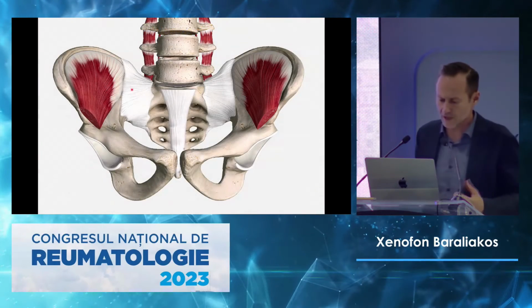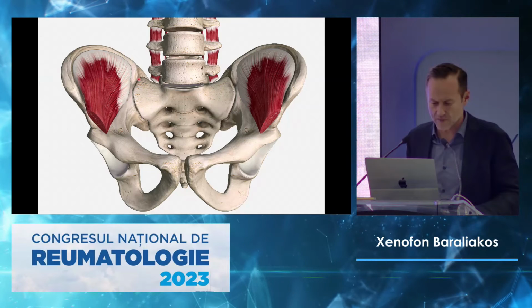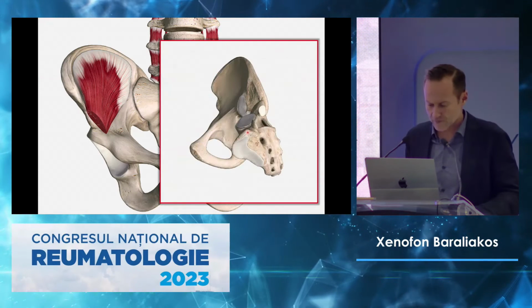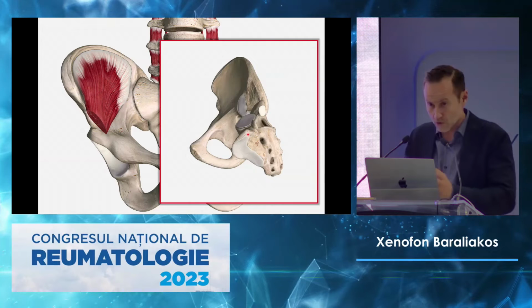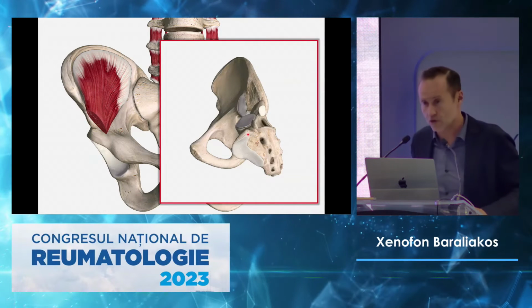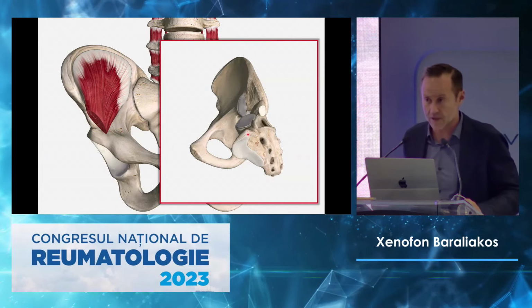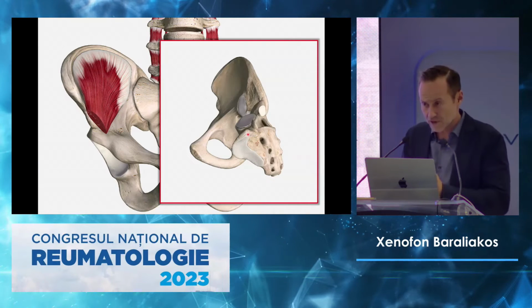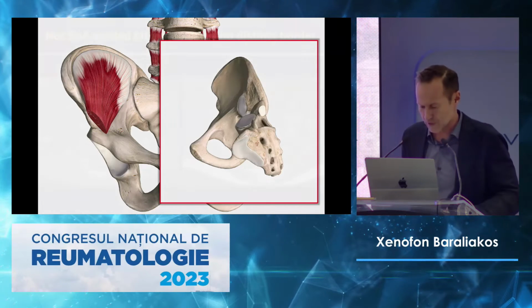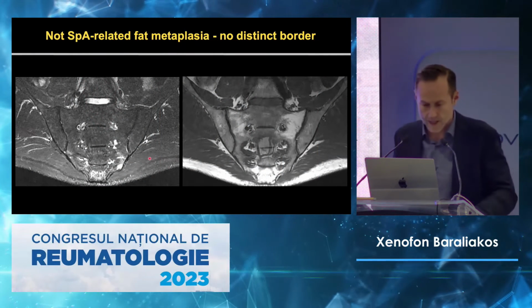So this is the anatomical part of it. You see, if you have that here in the upper part or in the very front, it's a little bit difficult to differentiate. Here the ligaments pull on the bone, and then you get the edema. You remember I asked also before, is it an enthesitic problem or is it a bone marrow edema issue? If you have an enthesis, it may also really pull on the bone and it causes you bone marrow edema. This is not SPA. Yeah?